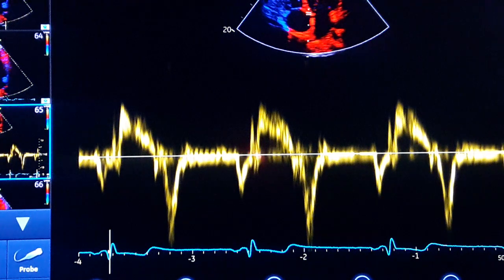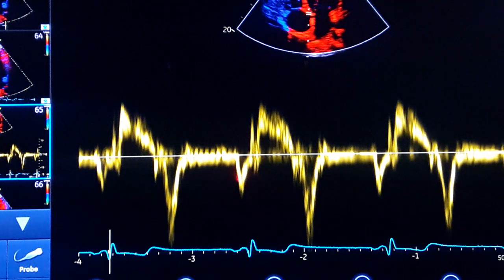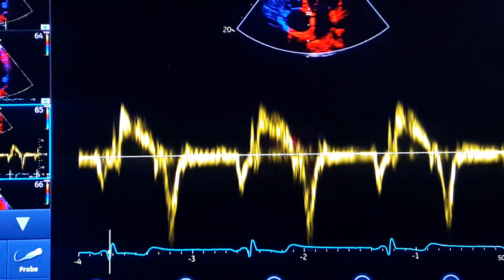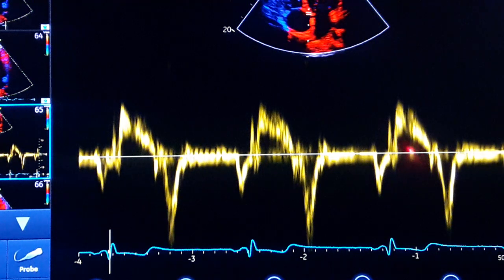In the tissue Doppler, we can measure the spot right before the systolic part — we call it the S-wave. This is exactly the isovolumetric contraction time, or IVCT. This is the end of the A-wave, and from this click to here is IVCT. At the end of the systolic tissue Doppler, from click to click on these parts, from here to here, this is IVRT or isovolumetric relaxation time. Between them is ejection time, from here to there.